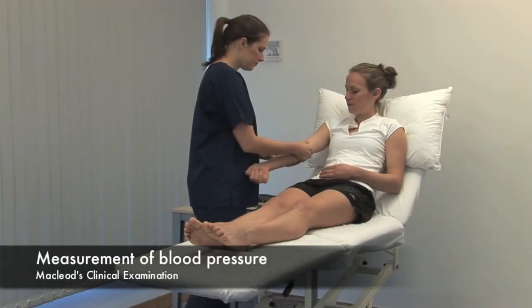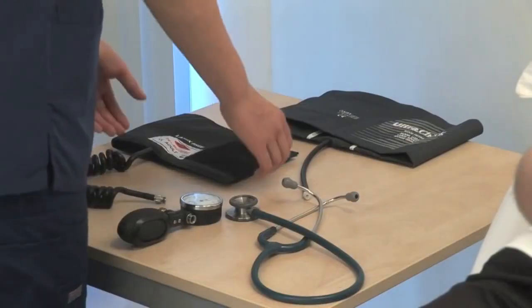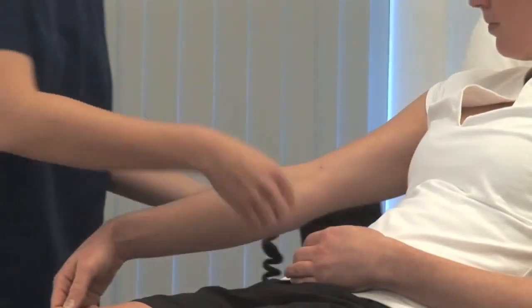The patient should be rested and seated or lying down. The arms should be comfortably supported at the level of the heart and free from constricting clothing.